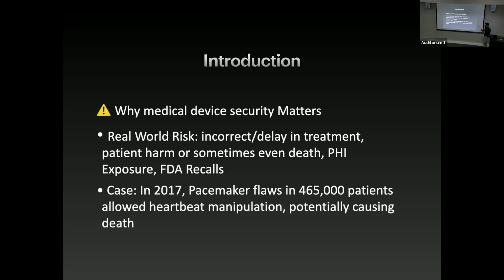So let's look at a real case here. In 2017, there was a pacemaker that was already implanted in almost 500,000 people. That device had a vulnerability allowing an attacker to remotely modify the heart pace of the patients it was implanted in. An attacker could run the battery dry. So anybody with a laptop and the knowledge of how to exploit this vulnerability could remotely trigger a heart attack. The exact details of this vulnerability were not disclosed, but the fix was released.